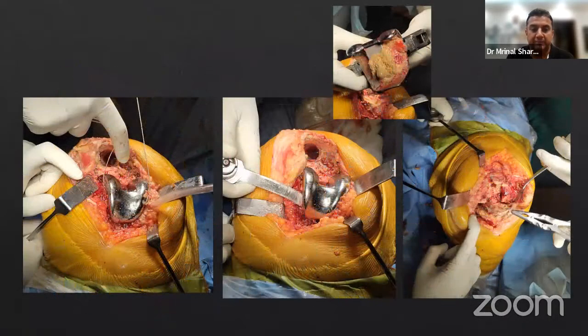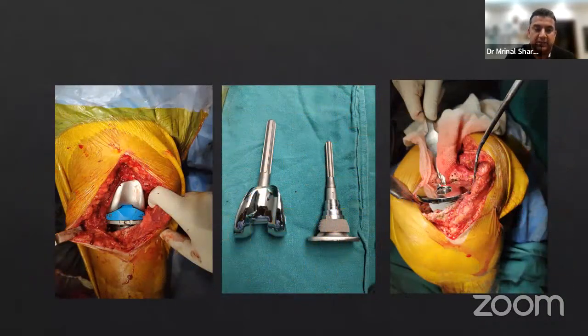After that, I remove the femoral component. I sometimes use Gigli saws and also thin saw blades and osteotomes to remove the femoral component with minimal bone loss. The trial was done with the trial components, and these are the final components with the tibial sleeve, and a TC3 constrained implant was used. Now we need to restore the joint line. You can still see that there's a huge defect medially, but on the lateral side, the tibial component is sitting on the tibia.